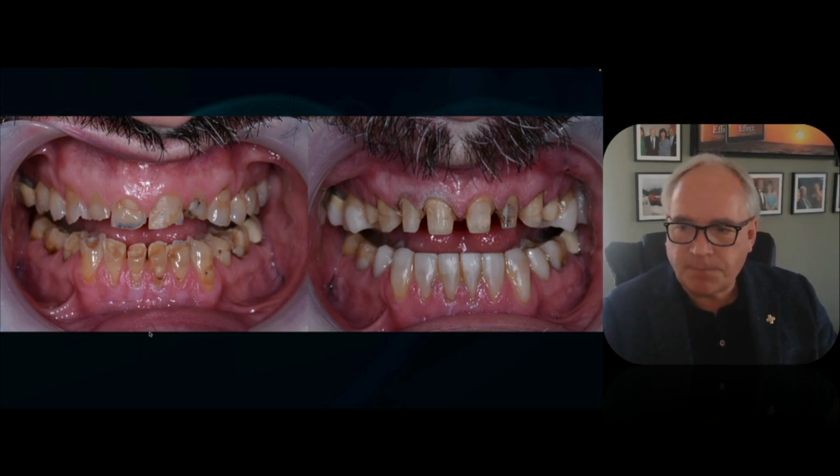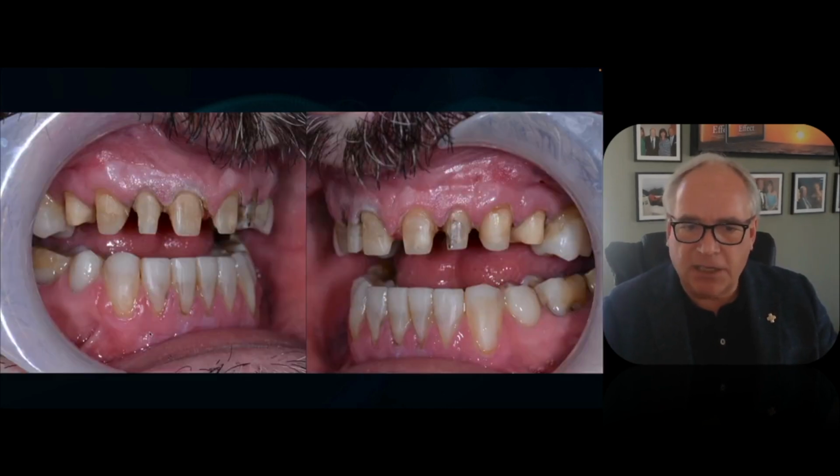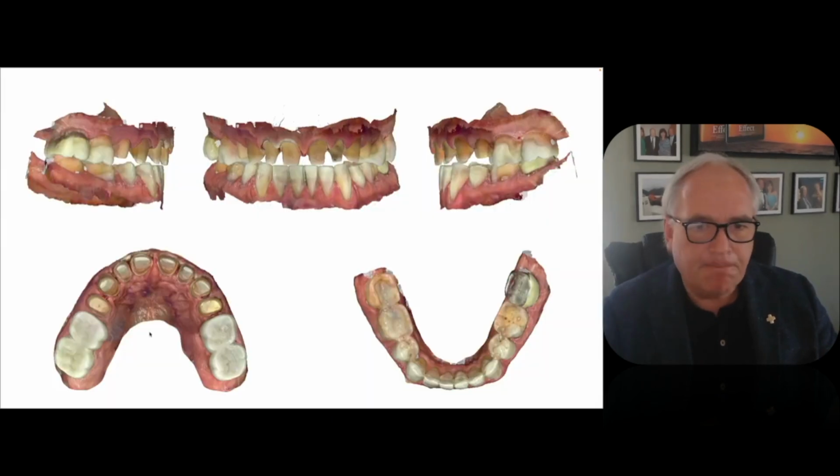Works great. All right, so looking at it, you can see the tissue heights are looking good, pretty level with the canines now. And I was able to build up the linguals and get nice ideal preps with plenty of ferrule for Brian here. There, the bite scans retracted.